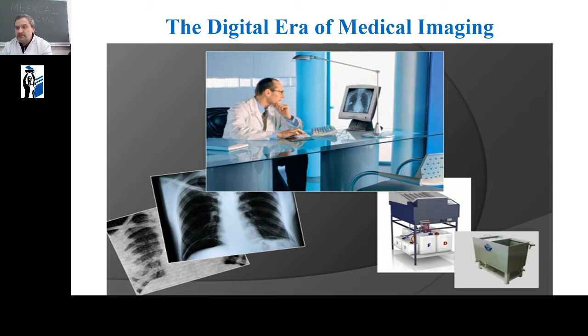The digital era allows you to present images on a computer screen, process and, most importantly, transmit them very quickly over special networks over long distances. Let me remind you that all medical imaging are united by the fact that they are all digital and they all have the same format, DICOM.